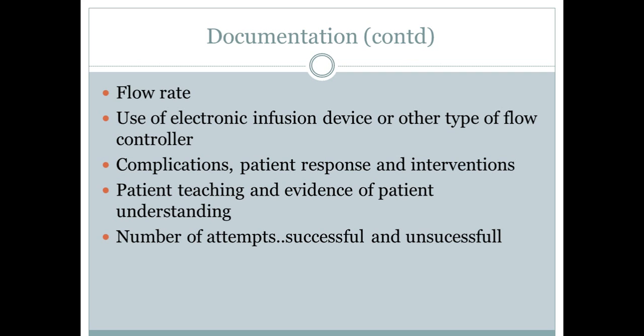when we do something new with the patient, whether it is initiating an IV or hanging an antibiotic or, let's say, just a continuous infusion of normal saline. We're always going to be educating that patient before we actually do something, especially with the antibiotics. Even if the patient had been receiving 2, 3, 4, 5 doses, it's still good just to let the patient know what you're hanging again if they've had it previous to this day, because those complications or allergic reactions can happen with subsequent doses. So always good to do that education, and of course follow your facility policy.